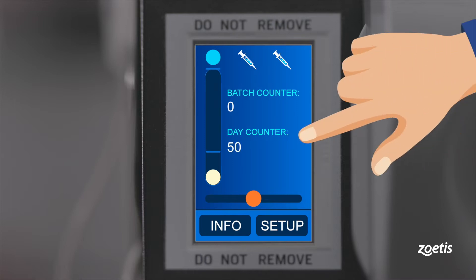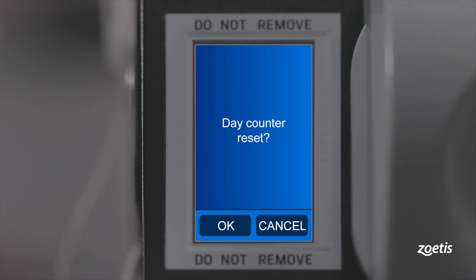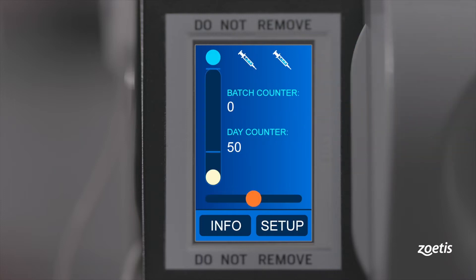Day counter indicates the number of vaccinated chickens since the last reset. By pressing the day counter, you can reset the counter.